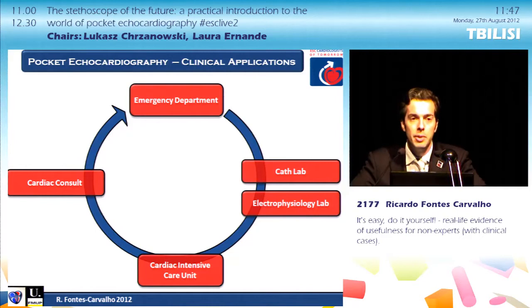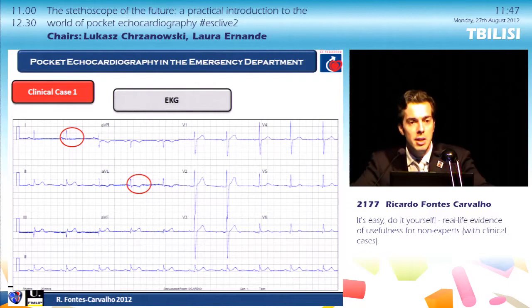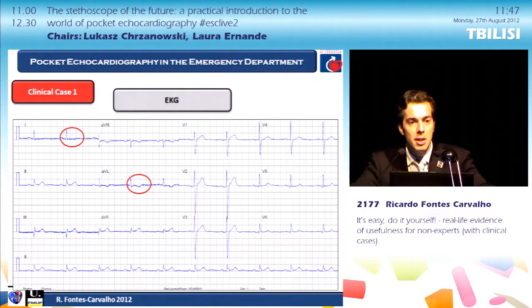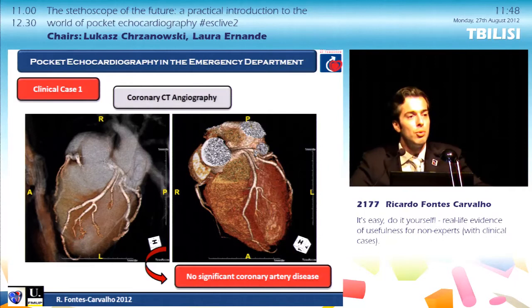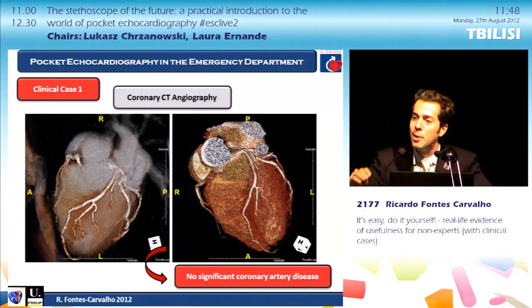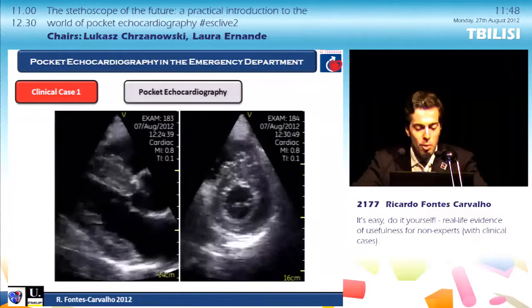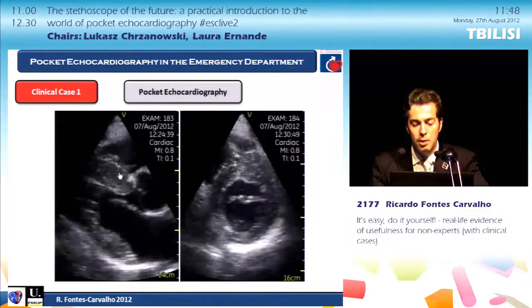There is a whole range of clinical scenarios where pocket echo can be used efficiently. Starting with the emergency department: this patient with cardiovascular risk factors came with retrosternal chest pain. His first troponin was negative and he had minor EKG changes in the inferior wall. Cardiac CT showed no significant coronary disease, and the patient was about to be discharged without a diagnosis. Because I had the pocket echo, I decided to use it, and to my surprise I could see a normal LV function but an asymmetrical hypertrophy of the septum and also in the anterolateral wall.